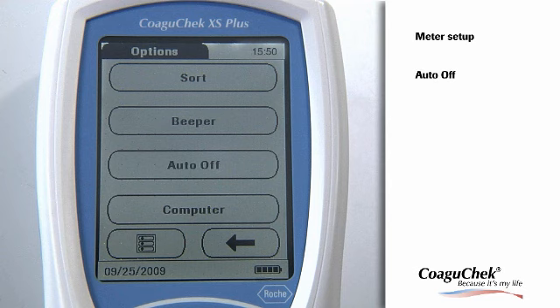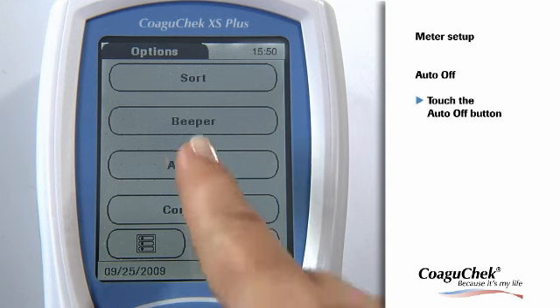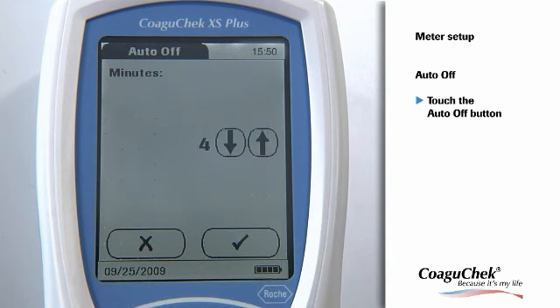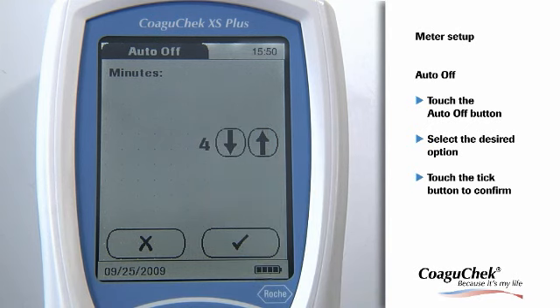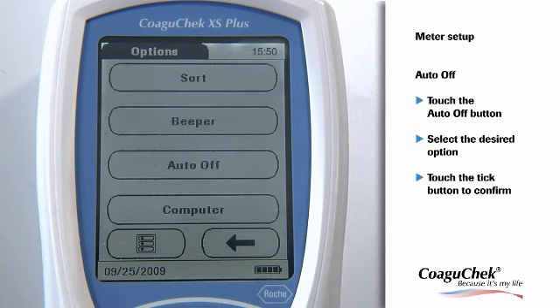To save power, you can set up your Coagichek XS Plus meter so that it powers itself off automatically if it has not been used for a period of time. Just touch the Auto-Off button to continue. If you wish to have an automatic off function, touch the arrow buttons to select the time of choice in minutes. Please confirm your setting again by touching the Tick button. The program automatically returns to the Options menu.